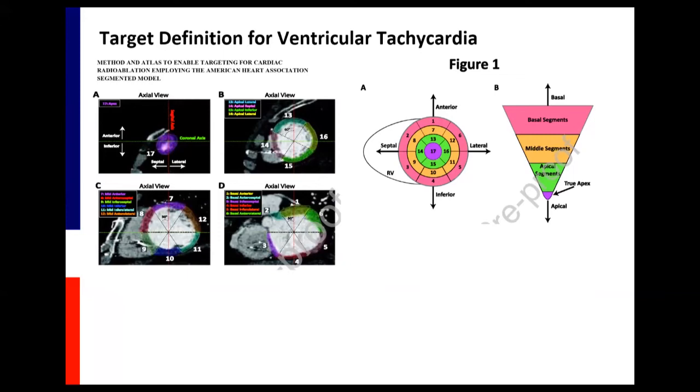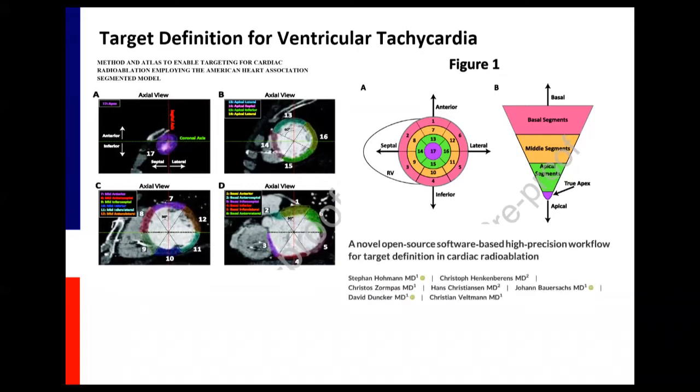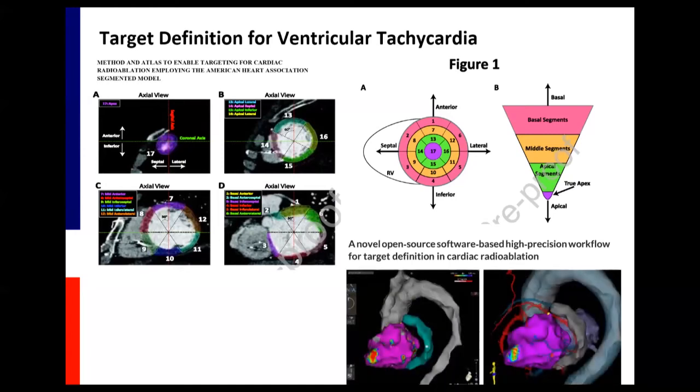So we're really treating a lot of cardiac tissue, which is scary, but it works, interestingly, and the toxicity is not very high. There are some other workflows that have been published, and you did show that already, with integrating the cardiac system, so Carto or NAVEX or Rhythmia maps, or even CardioInsight onto the planning CT, which is the ultimate thing you want to do. We want to see basically the cardiology information here.